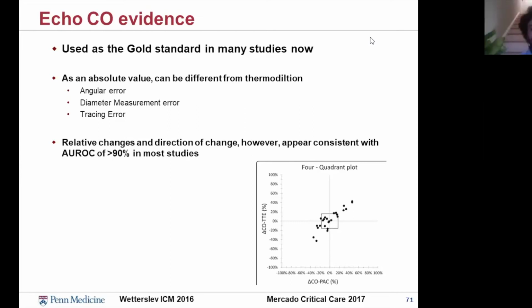Yeah. What are your recommendations for a correct evaluation and assessment in this kind of patients? Yeah, and pregnant patients, it's more challenging to assess them for a number of reasons. They have different flow states. They have compression of the inferior vena cava. So it certainly is more of a challenge.